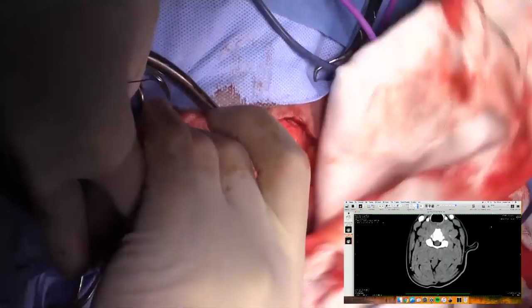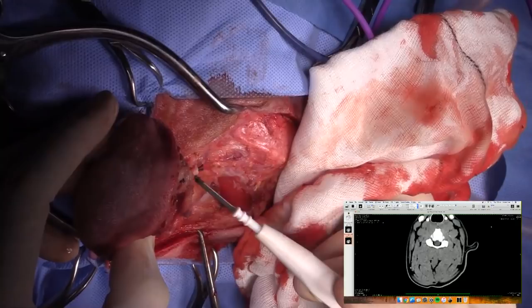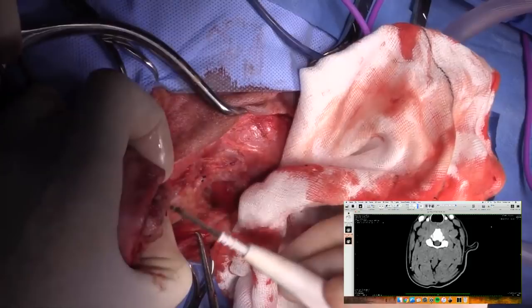In regards to the location of the incision and the orientation, someone's come a little late. So this is the mandibular salivary gland. That's rostral, that's caudal. We've just ligated the jugular vein, which was here, the maxillary vein, which is there, and then the lingual vein will be down here eventually. And I'm not excising the mandibular salivary gland because I don't believe that that's involved here. That's maybe a bit of parotid salivary gland.